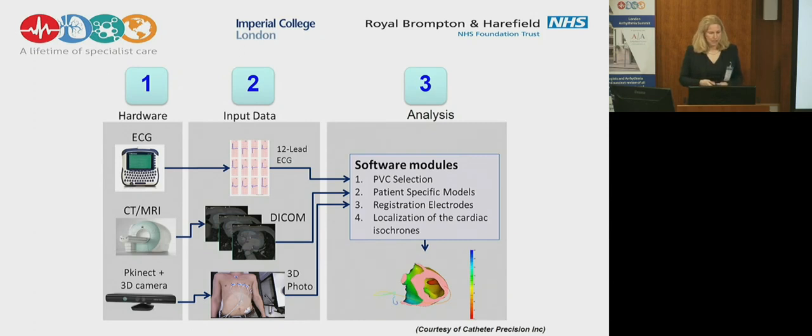exit site. Now, if you think about it, how often, especially in an EP lab, do we actually have the 12-lead ECGs, especially the chest leads, in the right location? How many times do we compromise by putting the patches slightly differently? Because we maybe have to put the reference patches, we have to have the defib patches. How many times do I believe that V1 is in V1 position, but it actually is not? So many times that is actually the case, at least in my lab. I occasionally got trapped in this.